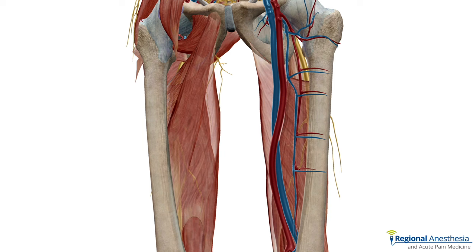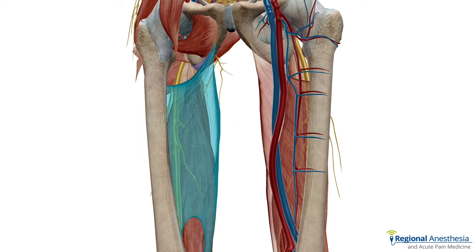If we look deep to the quadriceps muscles in the thigh, we'll first see the adductor longus, then deep to that adductor brevis, and then the aptly named adductor magnus. You can see the chunky sciatic nerve hiding deep to this muscle on top of the long head of the biceps femoris.